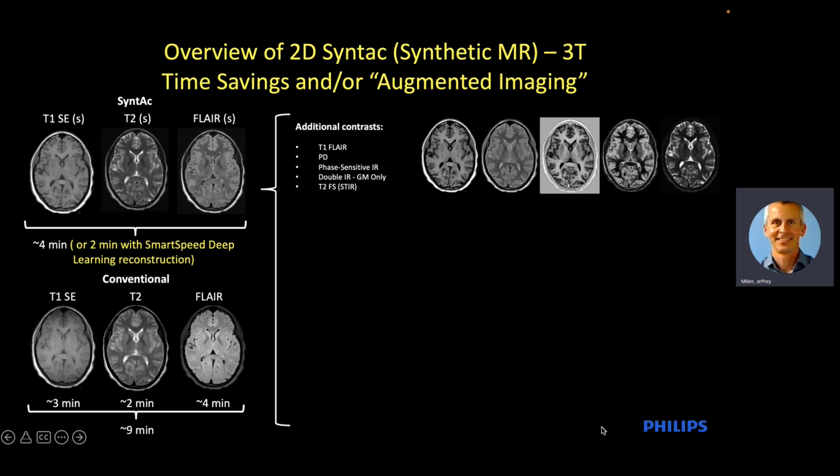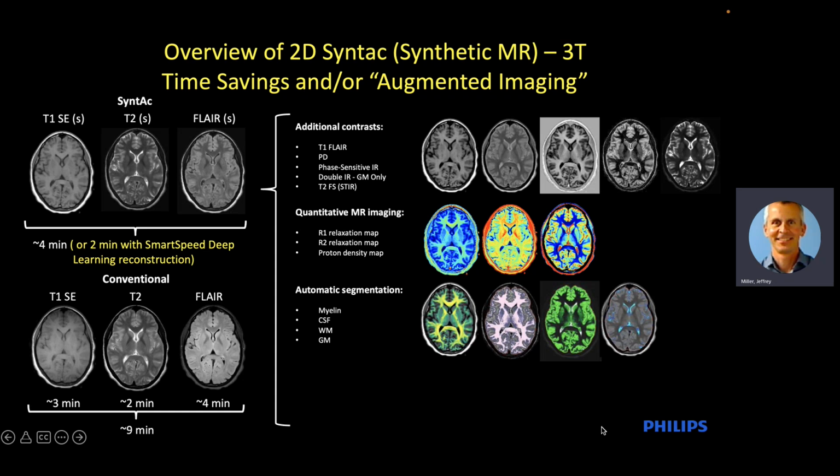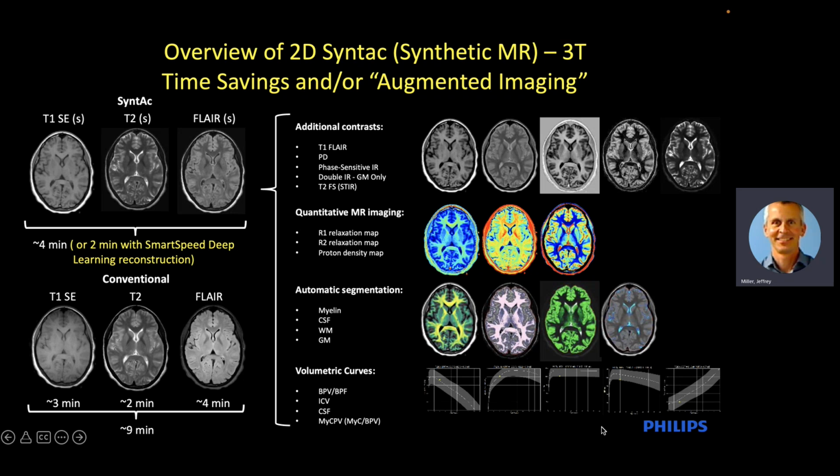What I'm going to focus on, however, mainly for this talk, is the other side of the synthetic MR coin: additional contrasts and quantification of tissue-specific parameters, which can be displayed as maps, graphs, and/or statistics.